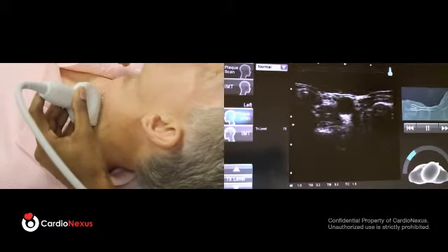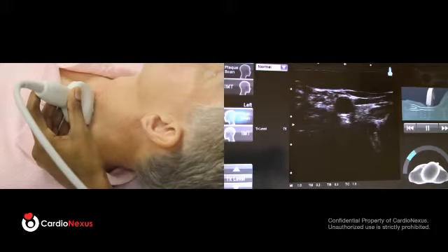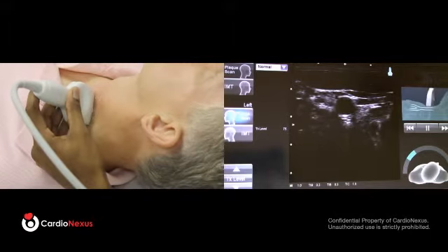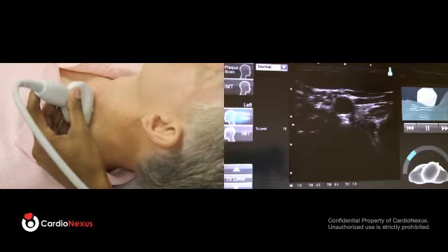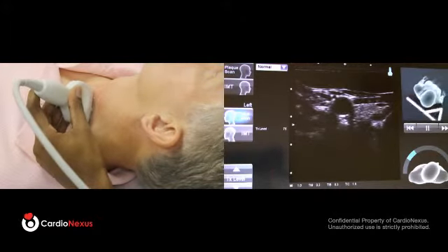And it's always easiest to start very low on the neck. The reason being, you have a lot of brighter echogenic tissue surrounding the artery, such as the thyroid and other muscle and connective tissue. So in most cases, if you position the probe as such, you will see one dark pulsating circle in the center of the ultrasound video, and that is a cross-section view, kind of looking into the pipe of the carotid artery.